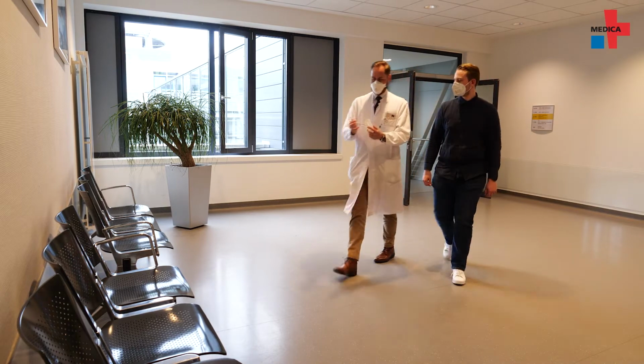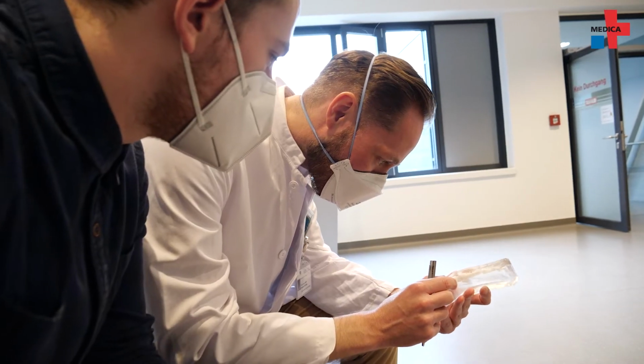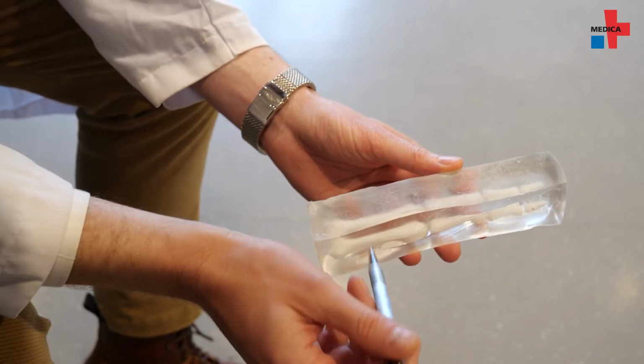For their project, the researchers are using a stereolithography 3D printer that uses photopolymerization. We use an SLA Formlabs 3D printer. The difference between the Formlabs SLA printer, stereolithography printer, and the homemade FDM printer is that we have resins which polymerize from monomers to polymers with a laser light. The important difference is that the resolution is very high for this printer.